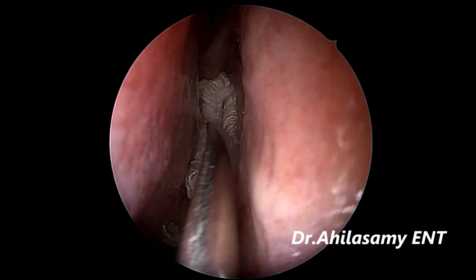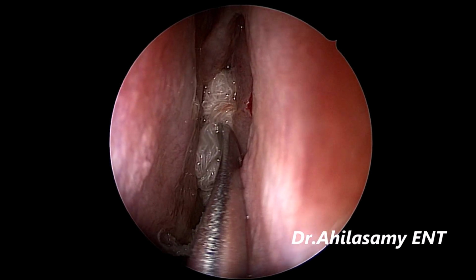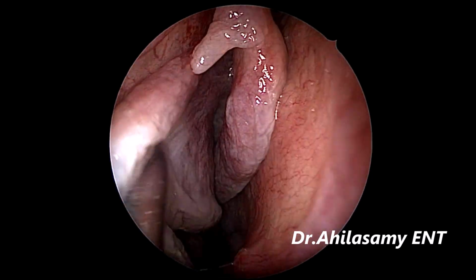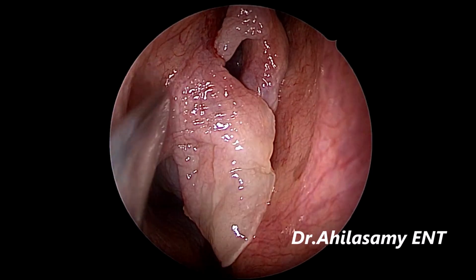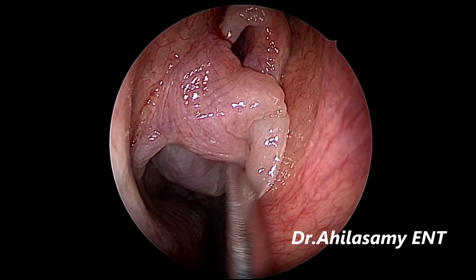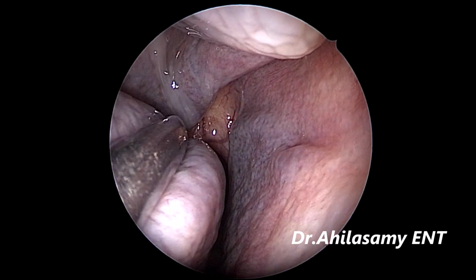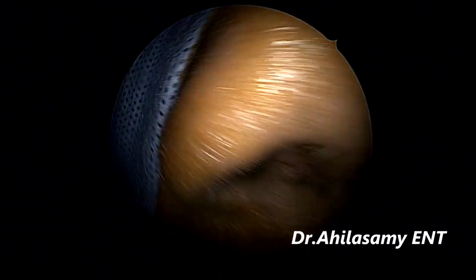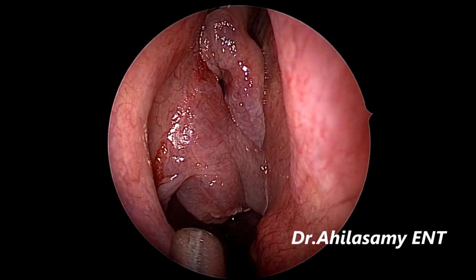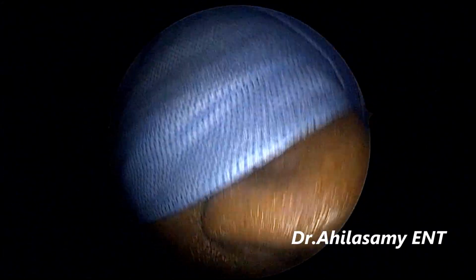Again, repeatedly pack to get a good decongestion with the pack, as I mentioned, 4% lignocaine and adrenaline in the ratio of 1:1. You see, the polyps are well decongested. It is arising from the uncinate and more polyps. I could see the sphenopalatine area, so I'll be giving the sphenopalatine block in this case. So no need for a greater palatine block.